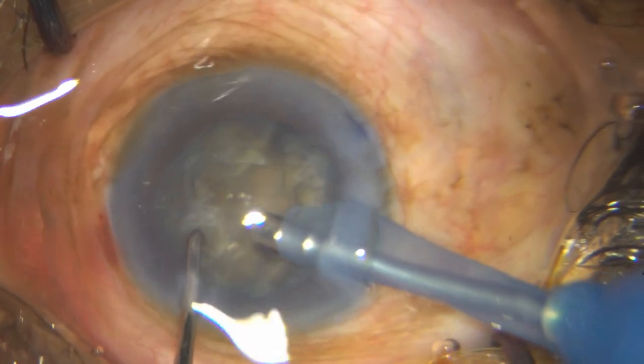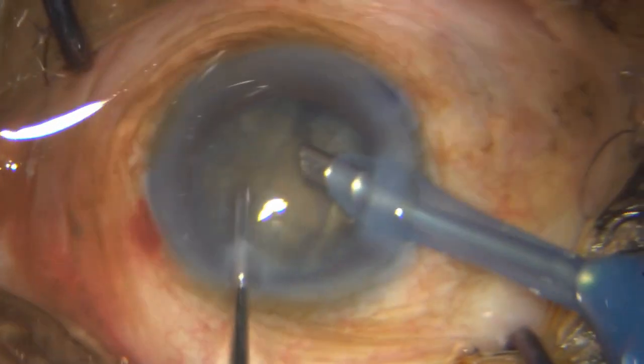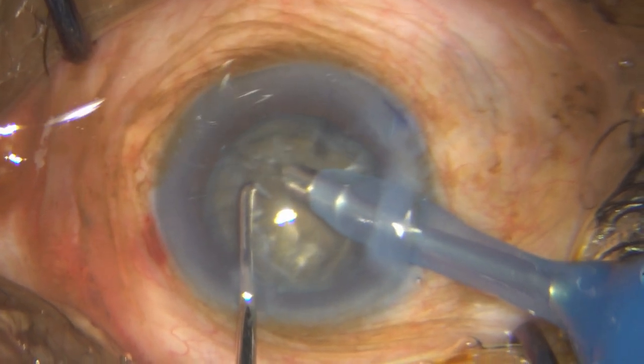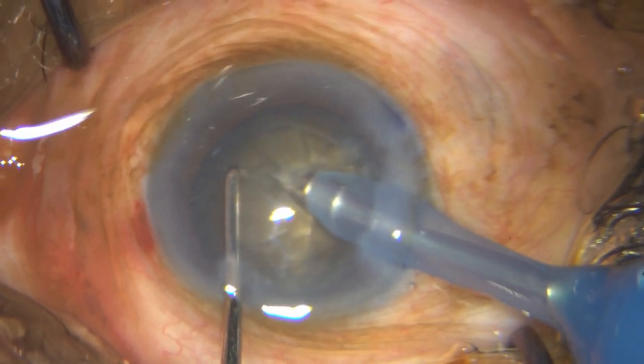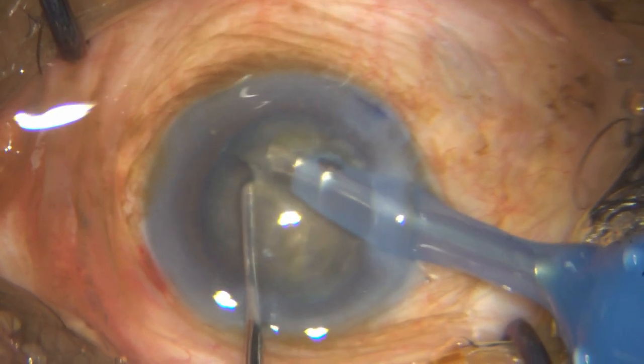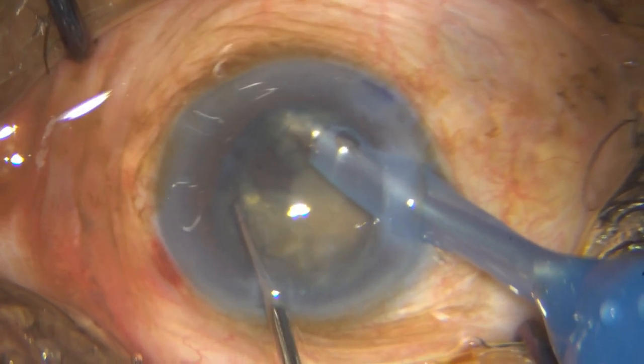Before you start removing segments, I always make it a point to take out this disc so I can observe what is happening behind. In a cataract like this, you have to get a minimum of six pieces, if not more. For each hemi-nucleus, I target at least three segments.